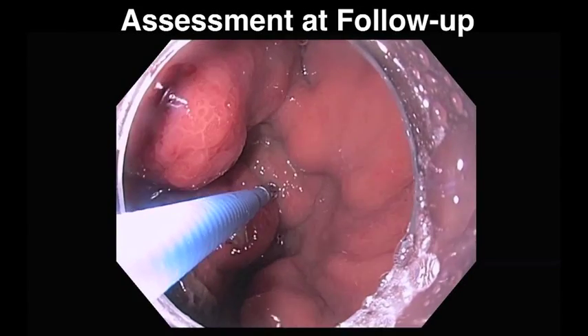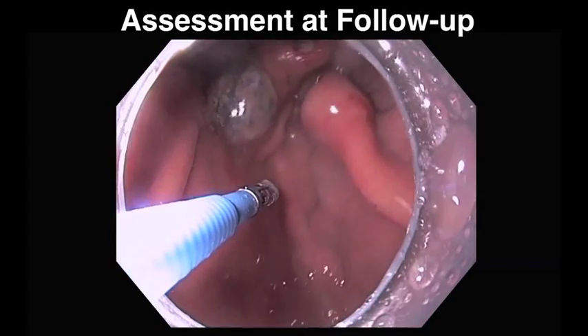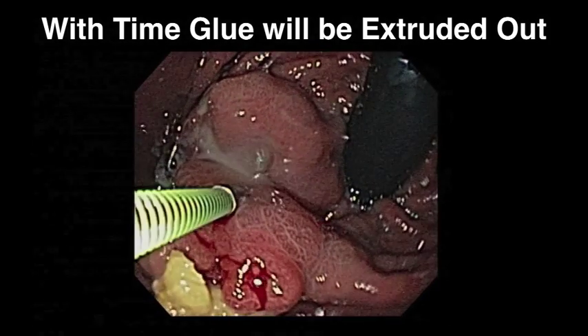In the following teaching video, we will describe the endoscopic gluing technique using the cyanoacrylate superglue. We will focus on the most common indication of its use: the treatment of bleeding gastric varices.